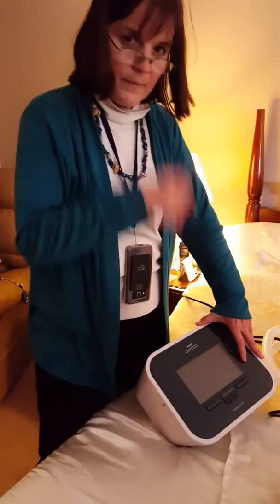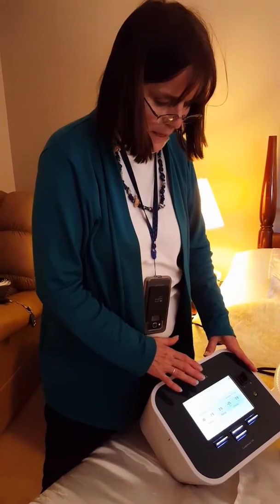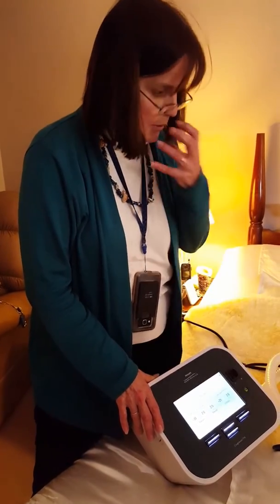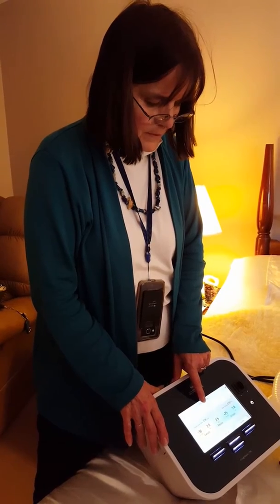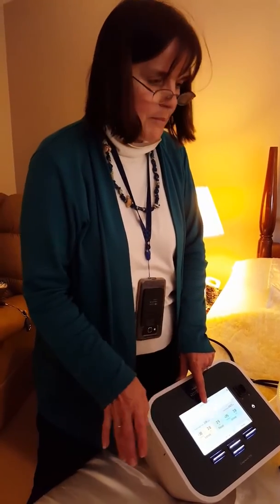To turn it on — okay, so you just turn it on and this gives you the power. Then when you want to give a treatment, put the mask on and push inspiration, expiration, and pause. You do a series of four of those and then take a break.